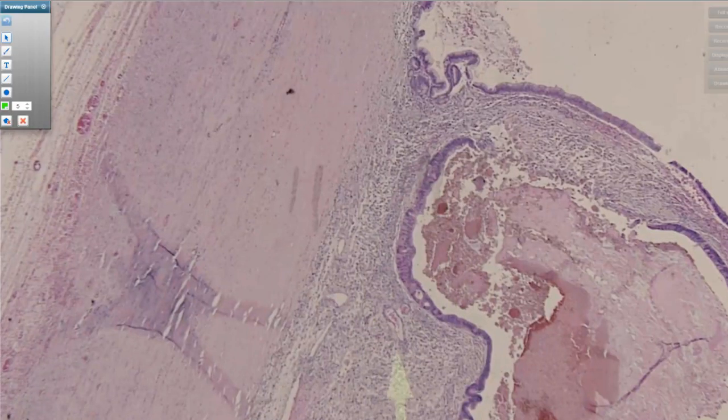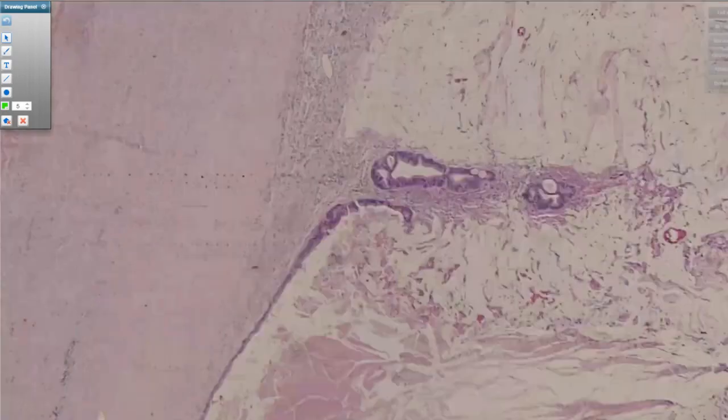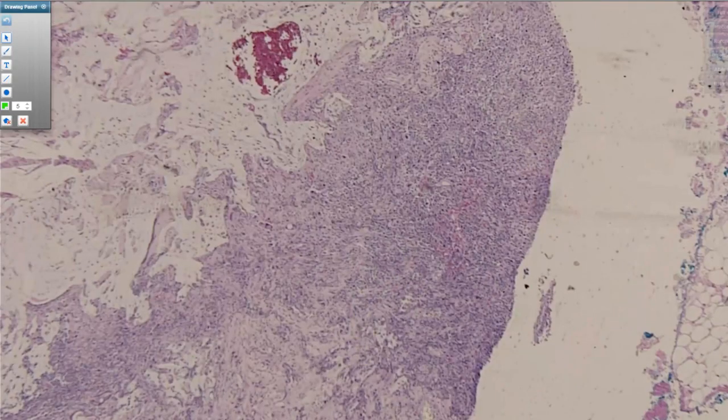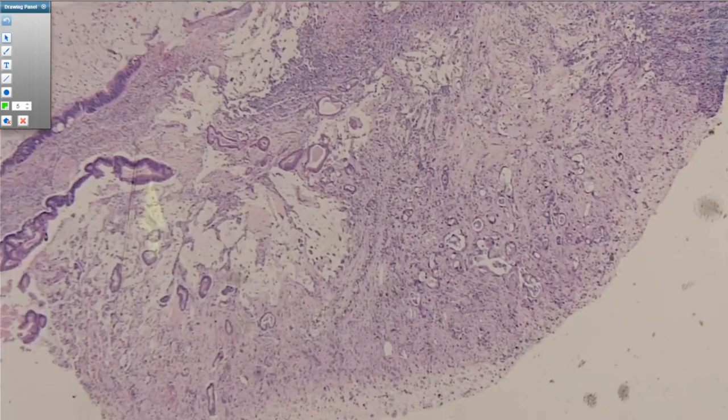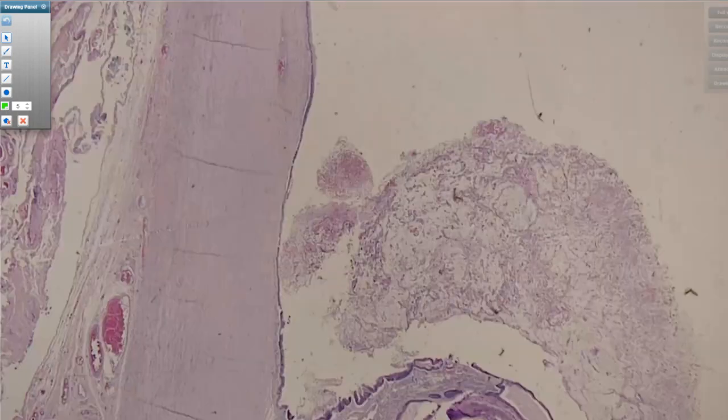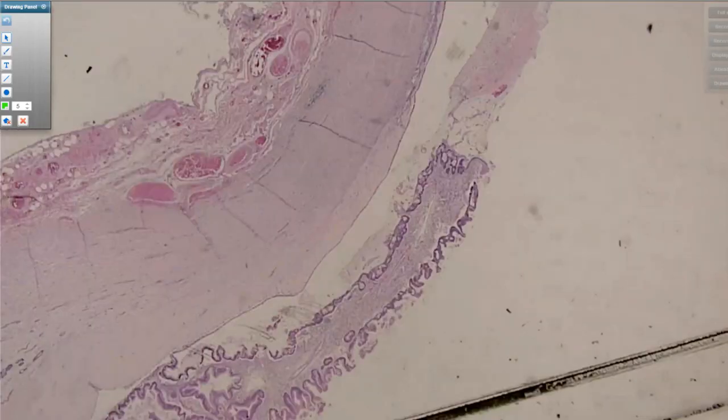So it's all still confined within the cyst wall. And so despite the fact that these undifferentiated carcinomas are typically very aggressive, in this case, if they're confined within the ovarian stroma, they probably do quite well. And just an unusual tumor arising within an MCN.